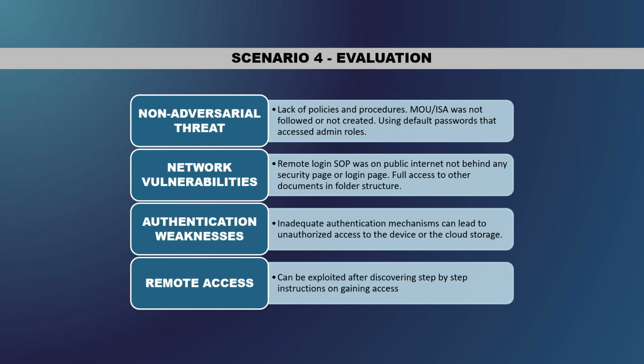But when they actually put it on their site, it was not behind any login page. It was just open to the public internet. You could just search it. And then it was also the default admin password to access the server as well. So that goes to another point: making sure you actually change the default admin passwords. You might get pushback from the OEM or vendor, but at that point, it's like, well, we already implemented this device throughout the nation, and this password needs to be changed.